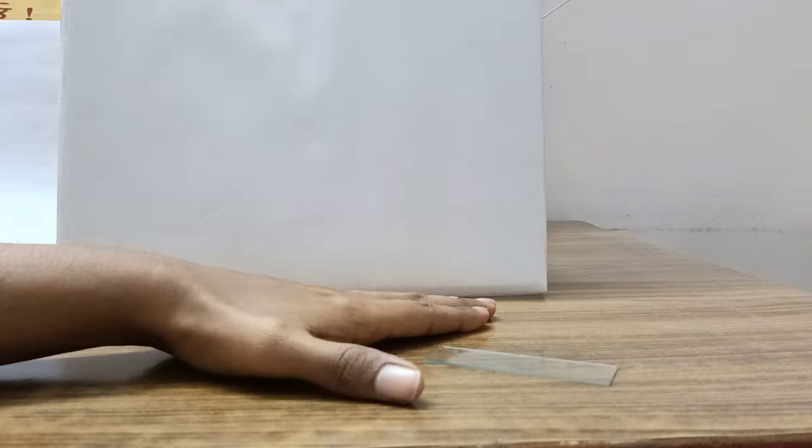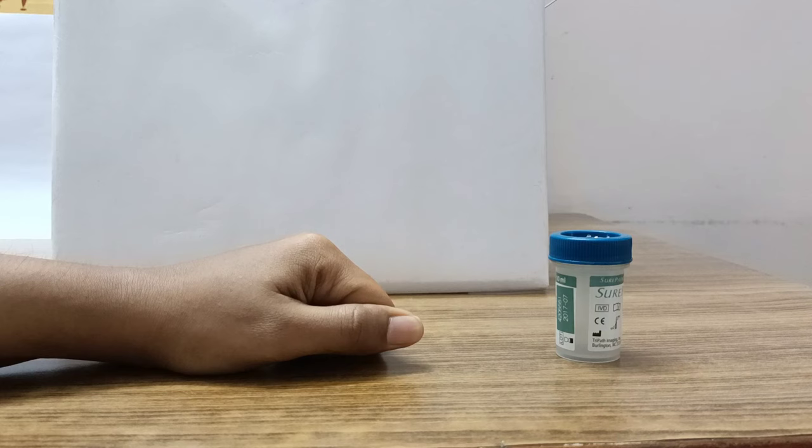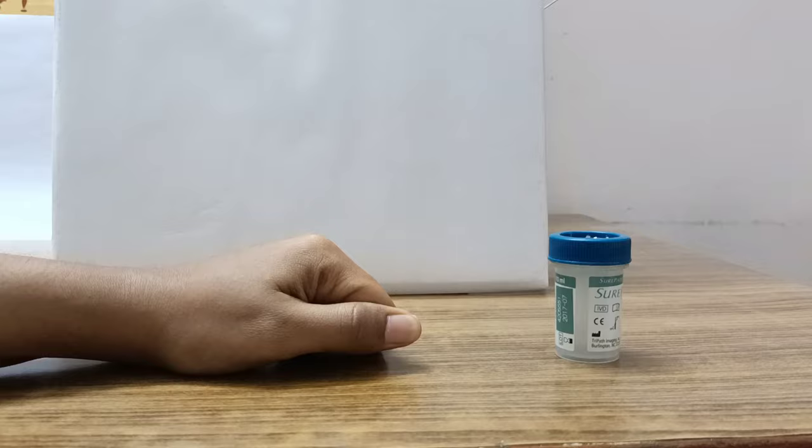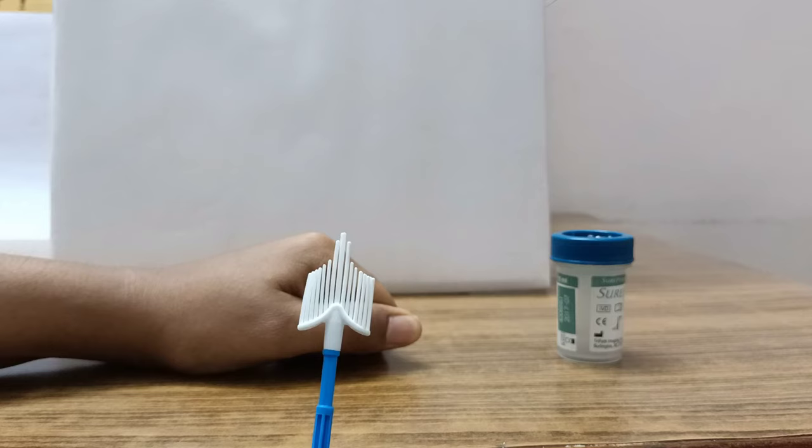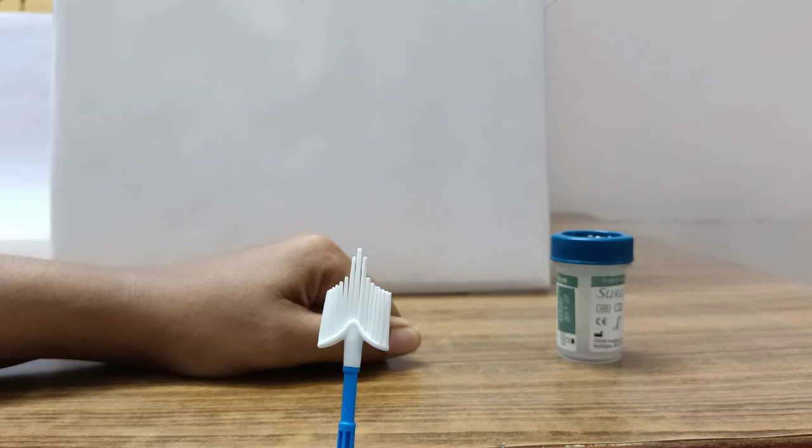Now there is a new technology - the liquid based cytology - for which I will require a cytobroom or combi brush. This is a cytobroom - it has bristles over it and also has a tip in the middle which goes right inside the endocervical canal.